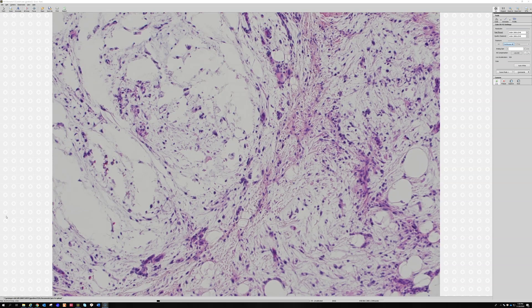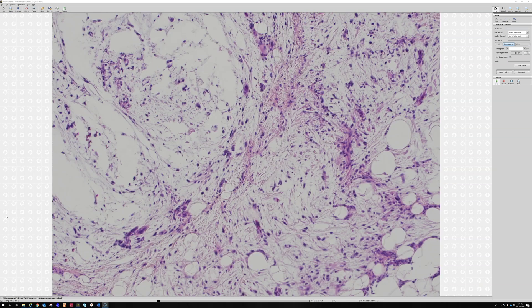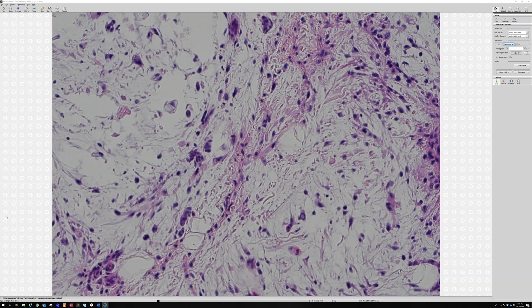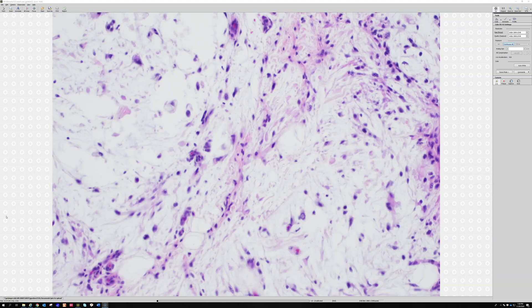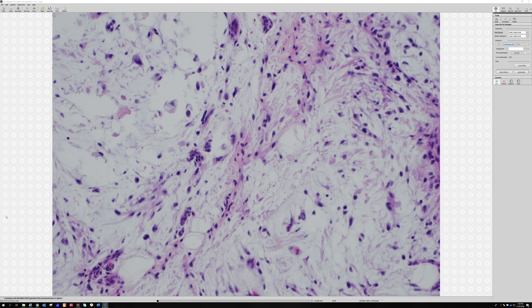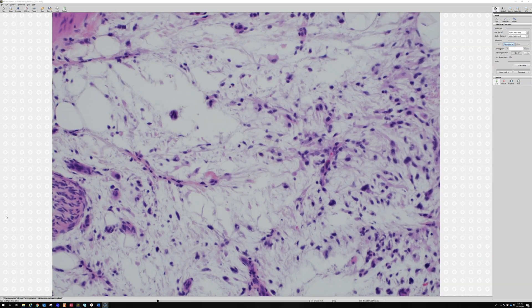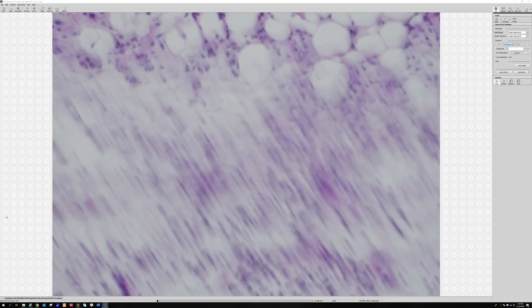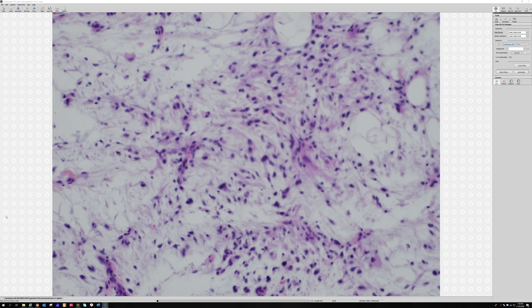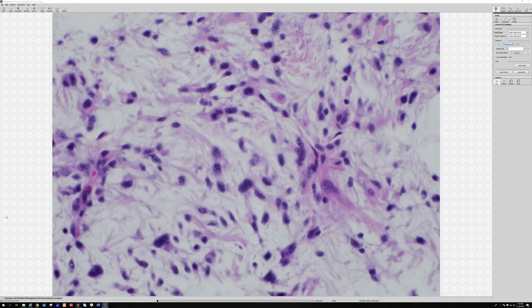That's exactly what it is. Good job. You've got myxoid, very infiltrative growth, and if we go look around, even though it's not super ugly from low power, it's very hypocellular. When we look around, we begin seeing scattered hyperchromatic, atypical cells.